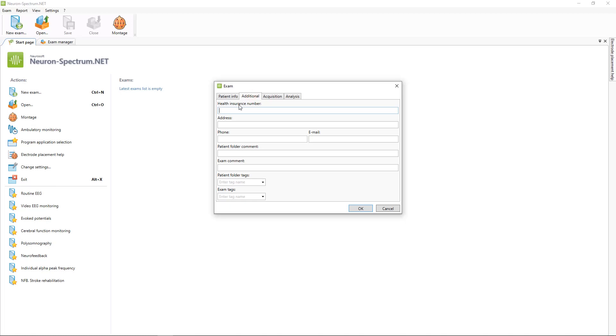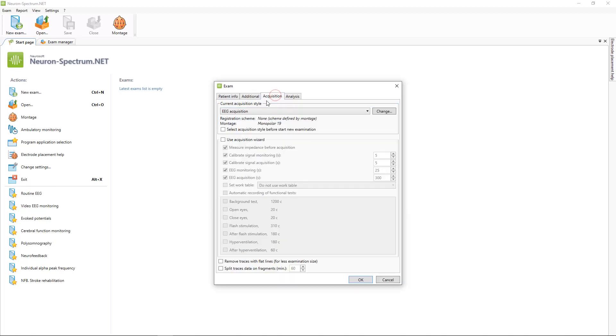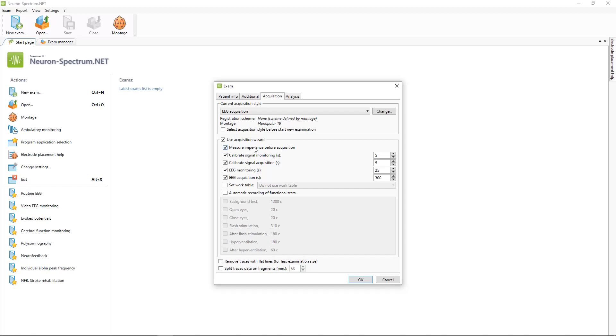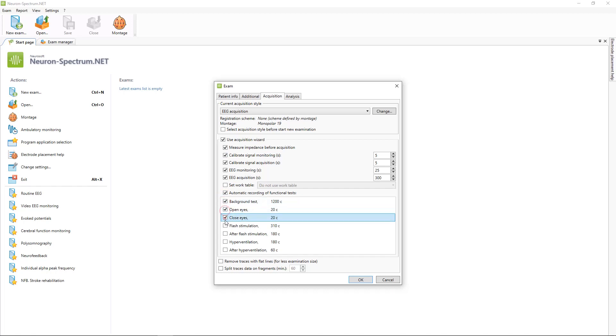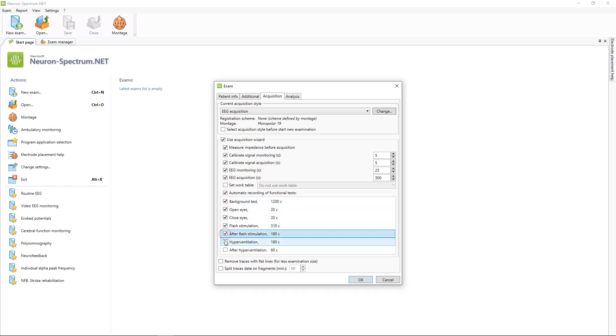Also in additional tab, on acquisition tab you can see current acquisition settings and you can change it before the start examination. For example, you can use acquisition wizard. With help of this tool, you can automatically record all parts of the examination, including functional tests which you selected.